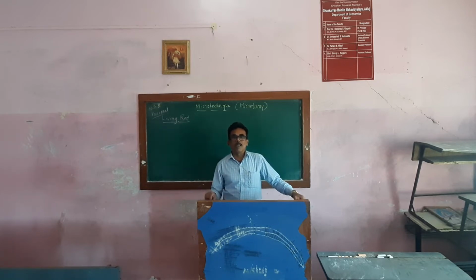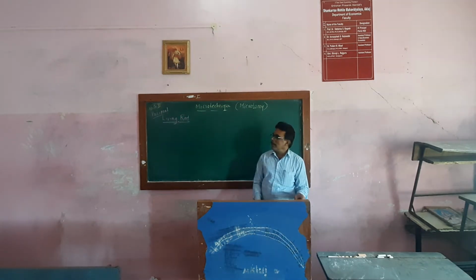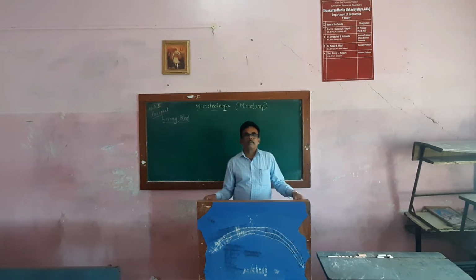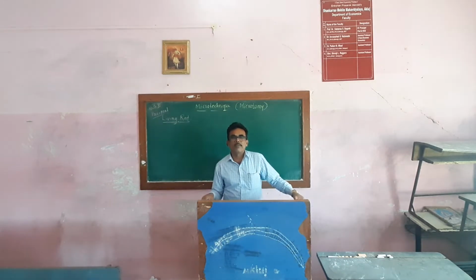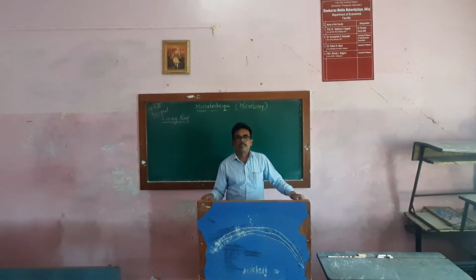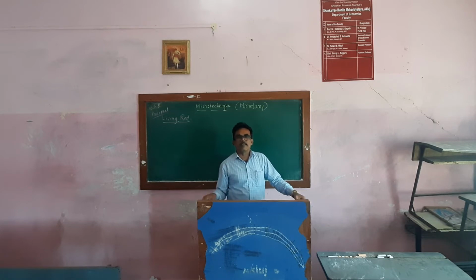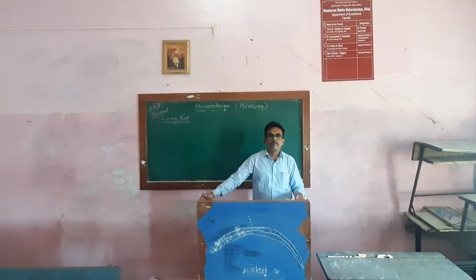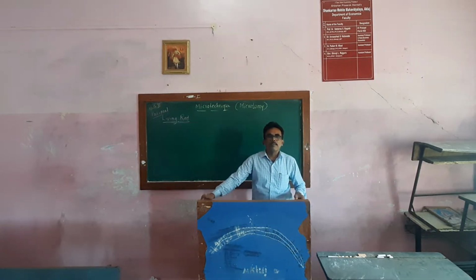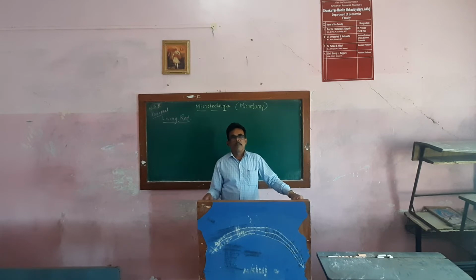After transferring the rat into the wire bag, we can catch the rat's head and disturb it by the stunning technique, or by any weighted material we beat that particular rat and damage its brain.